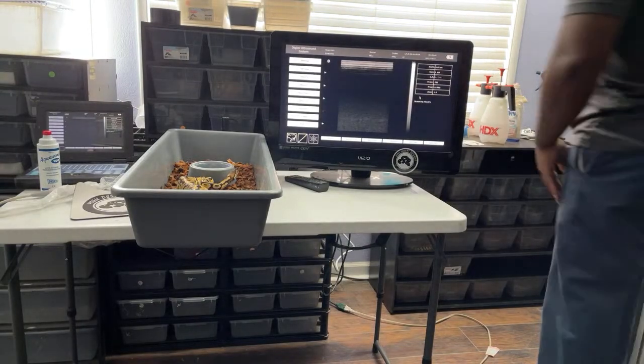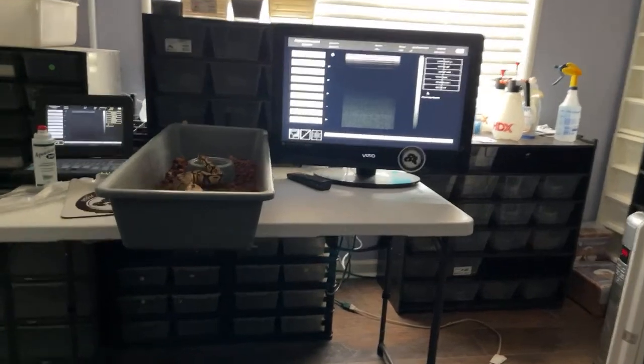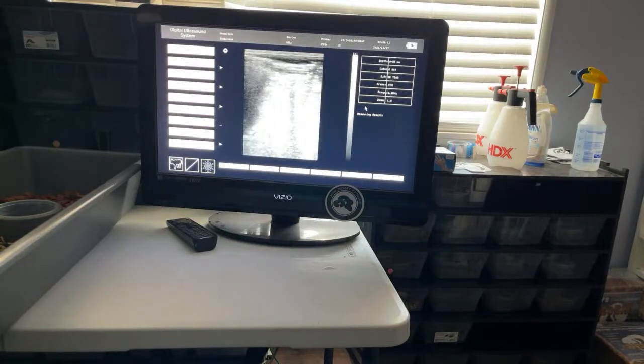Let me know how the screen looks in a second. Got a little bit better on the screen. Probably a little closer. Yeah, you can get closer. A little bit closer. The ultrasound medium I use is the Aquasonic 100, a transmission gel. You can get it on Amazon. It's pretty cheap. I got the real big bucket, and it comes with this neat little container right here to make it easy to travel with.